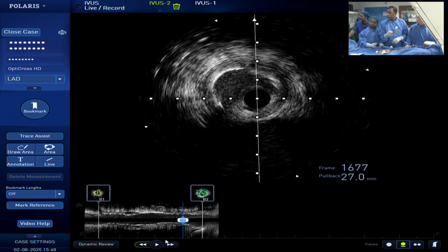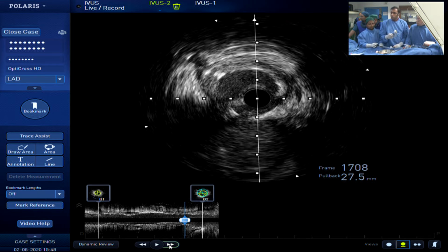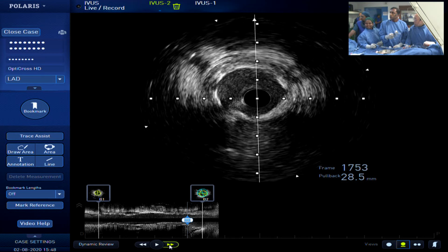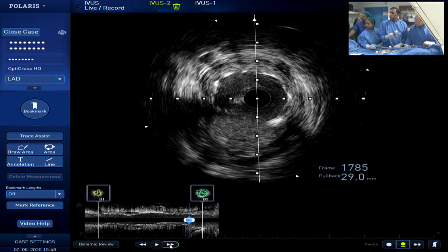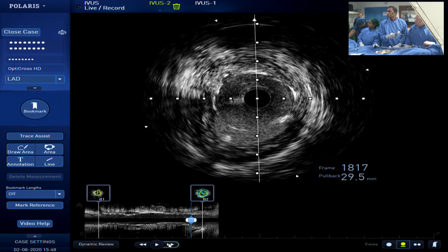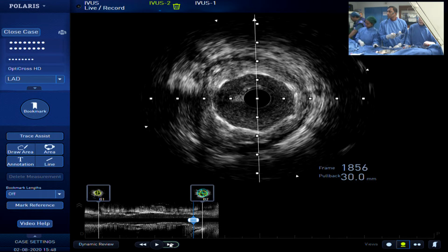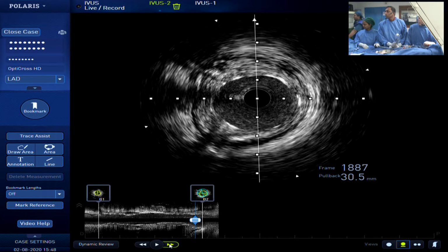Now the wire is moving proximally, slowly. Yes, much slower, slower. Now the wire comes at 6 o'clock, right? Yes, and then comes. Yes, still the side branch. Yes, 6:15. Yes, comes. Still, yes, under the stent strut. And then still under the strut, and then comes out, still under the strut, yes. And then still under the strut, and then comes out.